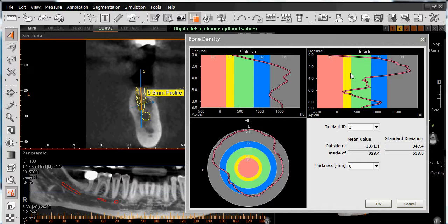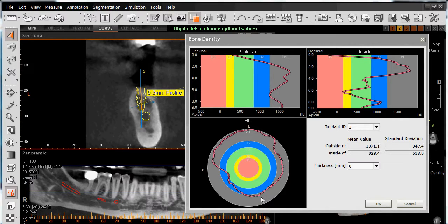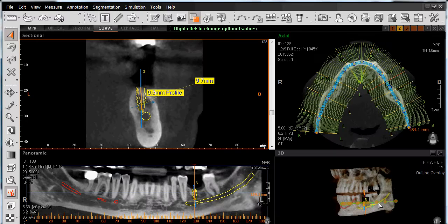We can also assess the quality of the bone looking right at the threads of the implant. Looking at this chart, we'll assess the bone quality where the threads of the implant will be coming into contact and supporting our implant. At the bottom, we have the ability to assess bone quality looking around through the end of our implant, going lingual, buccal, posterior, and anterior. Once we've verified this information, we can then left-click on OK to close out the window.